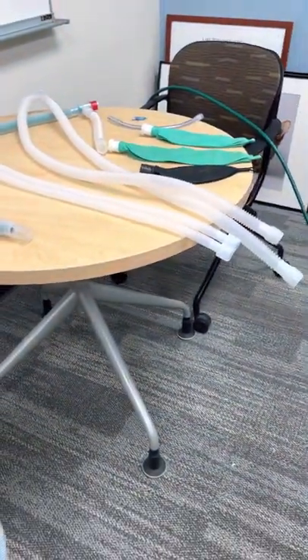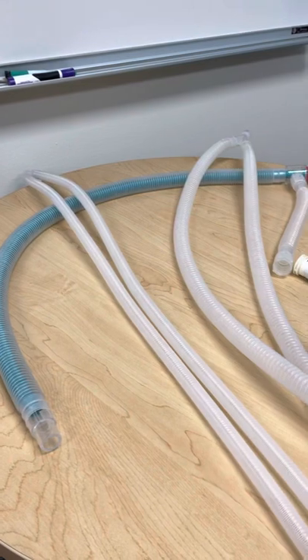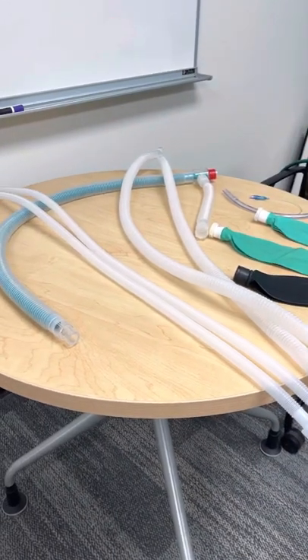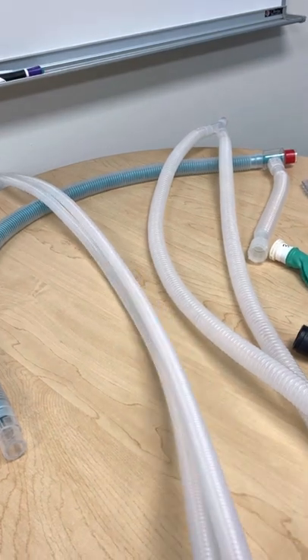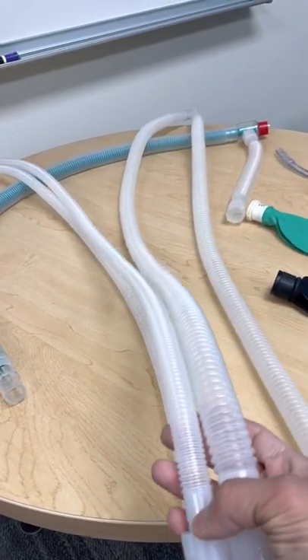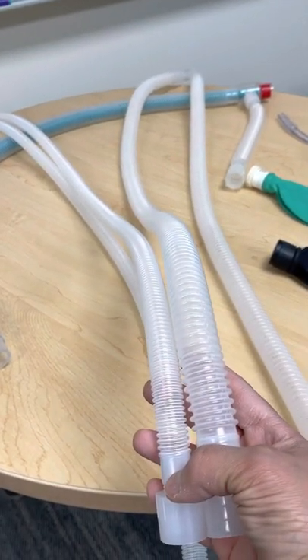Okay, we're going to discuss the small animal anesthesia machine. The first thing that we need to do is look at our tubes, and we're going to set this up as a rebreathing circuit. So I have three different tubes here that were discussed in your book. We have the small pediatric tubing, and you can see how much smaller that is from the adult or the larger animal size. And when I mean larger animal, I mean 7 kilograms or more. You can see the diameter difference in the two.